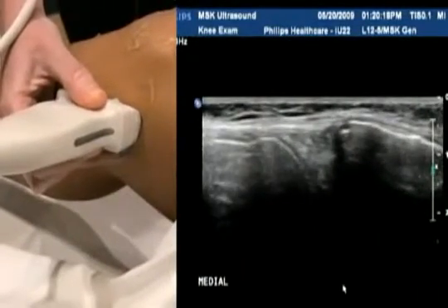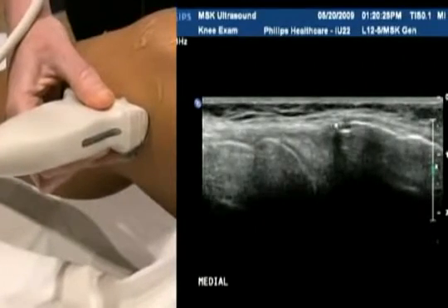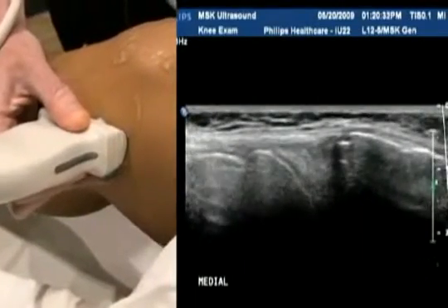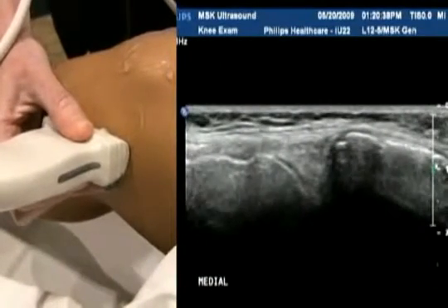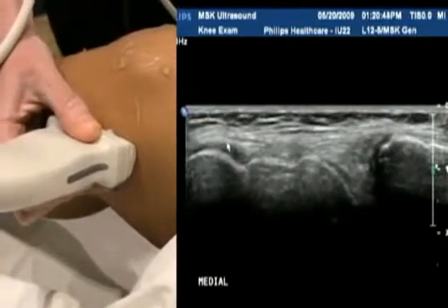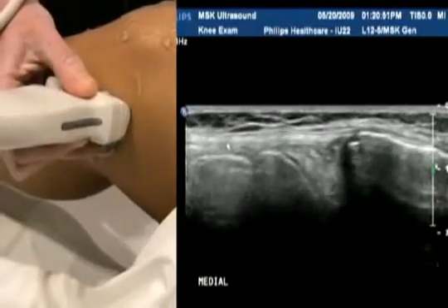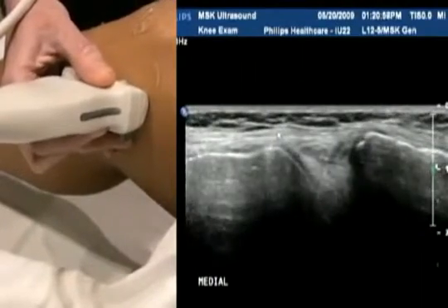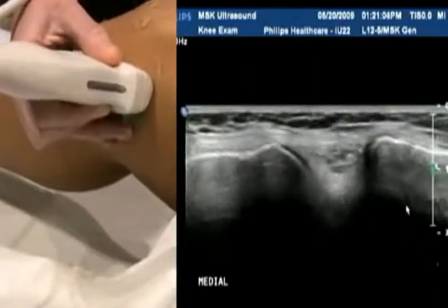It's a little easier to see on the medial side than on the lateral side — the medial collateral ligament. Let me just make that a little bigger and bring my focus up to where it needs to be. You can see here a number of linear fibres running across, attaching more proximally — that's the medial collateral ligament, the paired structure with the lateral collateral ligament on the other side. It should appear nice and thin, nice and taut. You'll notice the knee is slightly flexed for this procedure, so that's certainly something to be aware of.